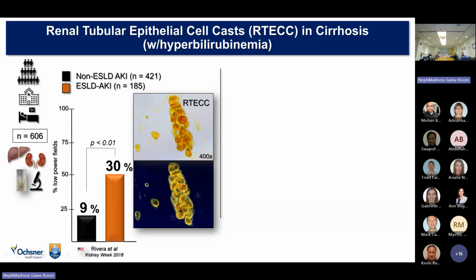This difference is very clear. You may wonder whether maybe the bilirubin pigment allows you to find them and it's not ATN. That's probably not the case, because we have performed a very careful examination using stains and ways that we can catch them, and we still see the difference between them.